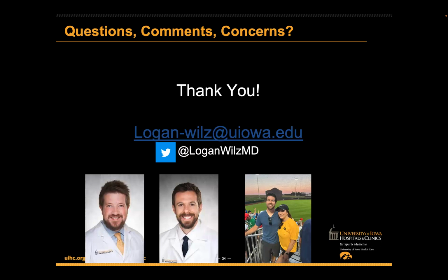So really nice job. I guess only two comments, maybe on nerve pathology, not really on scanning protocol. You made the comment about deep fibular nerve compression down at the foot from certain shoe wear and sandals. It can also get compressed under the EDB muscle or tendon. I've had a couple cases of that, so that's just something else to look for down there.